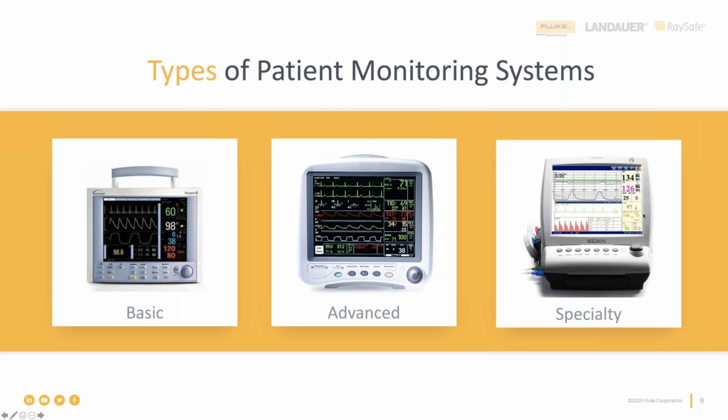where we went over what a patient monitor is and what it does in a general sense, but it's also important to understand the different forms that a patient monitor can take. There are so many ways to mix and match parameters, but here's a good general overview of the three main buckets that a patient monitor can fall into. First, there's the basic vital signs monitor. In the US, this can be commonly referred to as a nurse on wheels. And this is primarily used on patients whose condition isn't that bad or deteriorated.